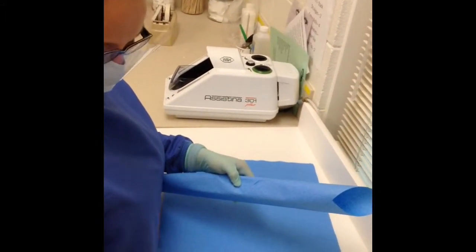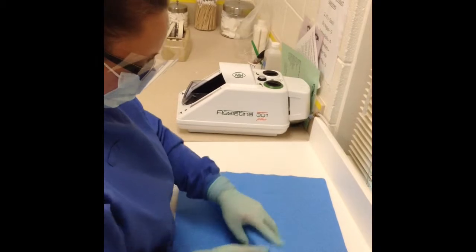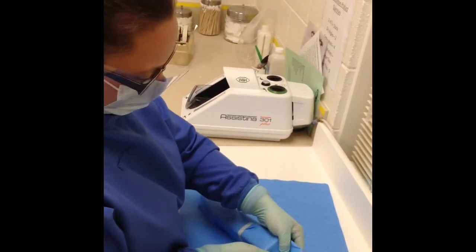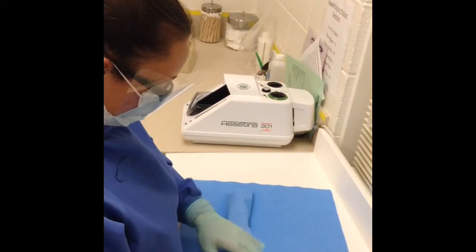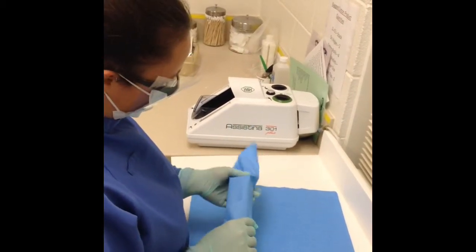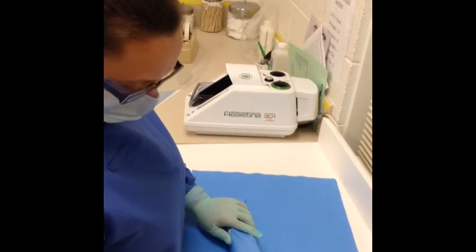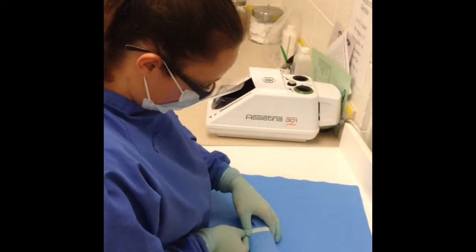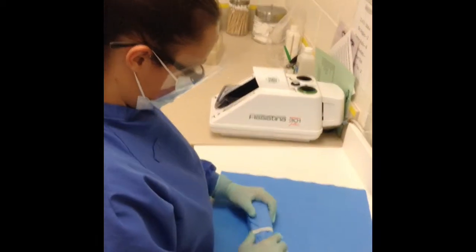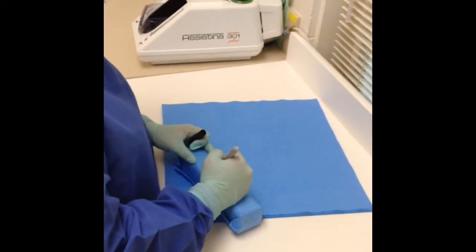She is going to use the autoclave tape to package it. The autoclave tape has a chemical indicator that lets us know by a color change whether or not the cassette is sterile. She is going to write on the outside of the cassette her initials, today's date, and the dental hygiene locker number on the outside of the blue paper.